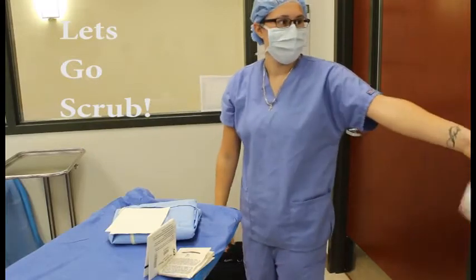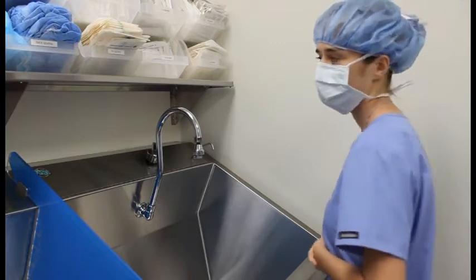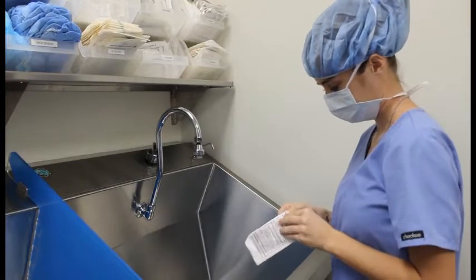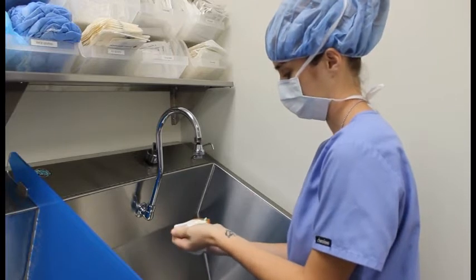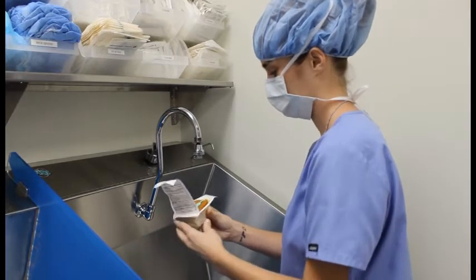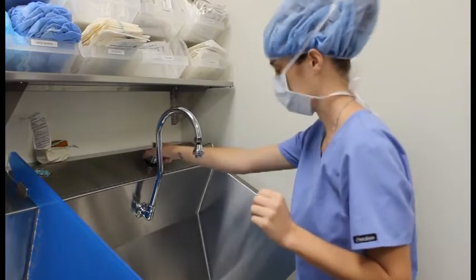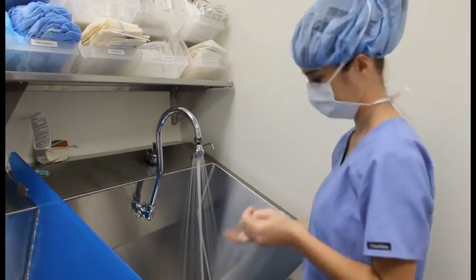Let's go scrub. Next step is going to be to grab a scrub brush with iodine. She's going to open it and put it on top of the sink. Next, she's going to set the temperature for as hot as she can stand it, turn the water on, and perform the initial hand wash.